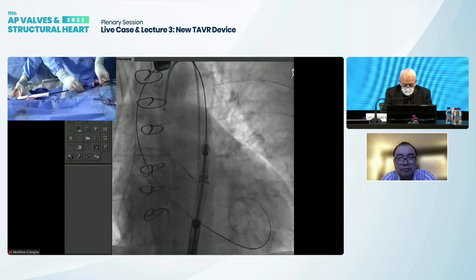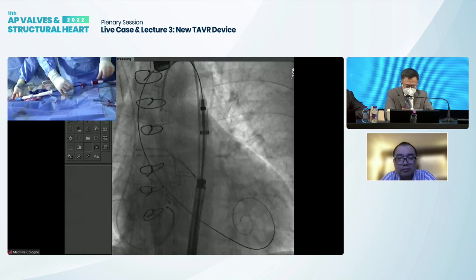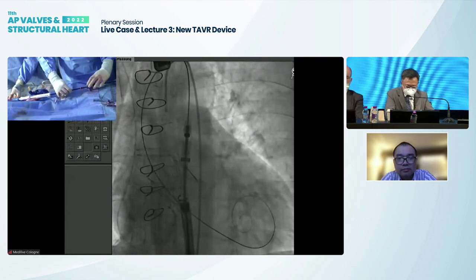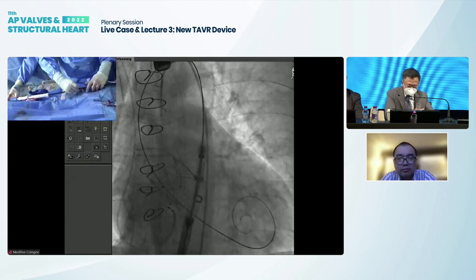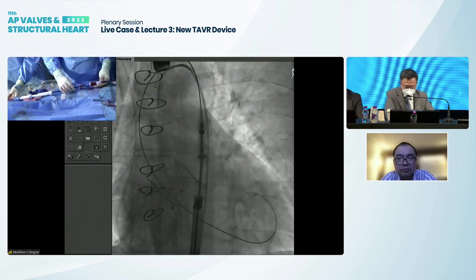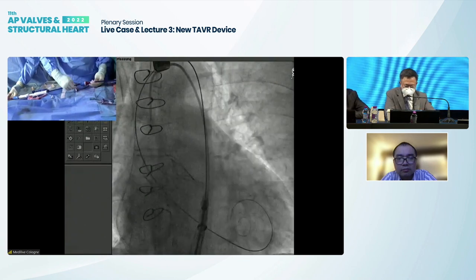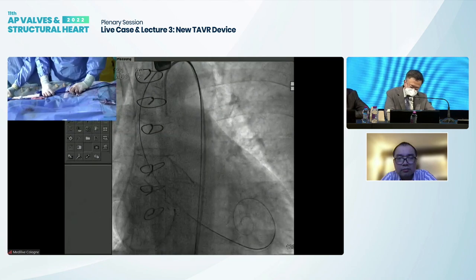There you go. So, Stefan, can I ask you a question? When you introduce the catheter into the sheath, and if you have the three locators put in a certain way, it most likely will come out correct, not upside down, not backwards, for anterior-posterior mismatch, right? Right. It's unlikely that it will be in the back, but off a little bit, not off the way back. It happens more often than you would anticipate. In general, yes, more than 50% are correct in the first place.